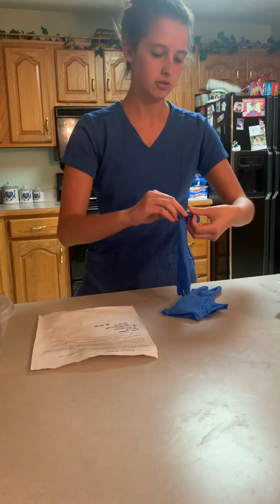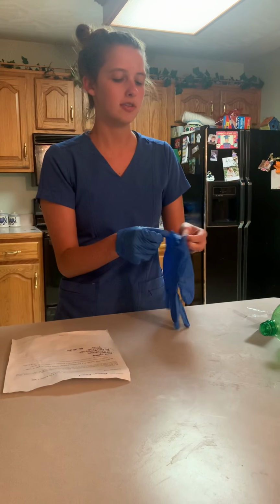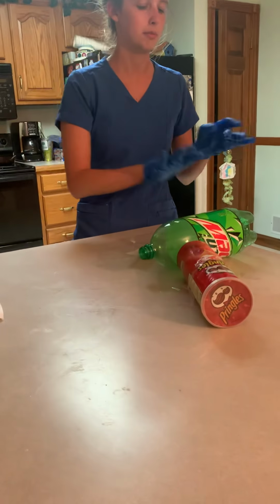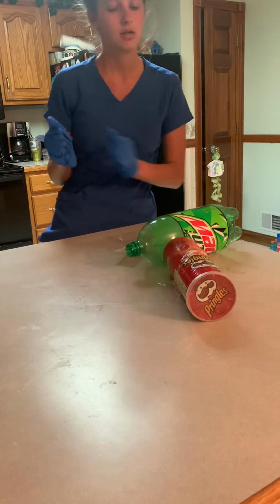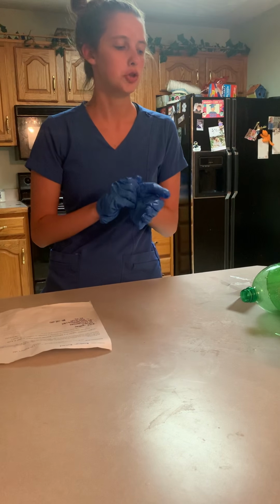And first what I'm going to do is assess the patient for urinary retention, and I will do this by percussing and palpating the bladder. Another way you can do this is by using a bladder scanner, but today we're going to percuss and palpate the bladder. So we're going to percuss, and then we're going to palpate the bladder. Okay, and I did notice that there was some dullness upon percussion, and whenever we palpated, we were looking for urinary retention, and so therefore we were going to go ahead and continue with the procedure.